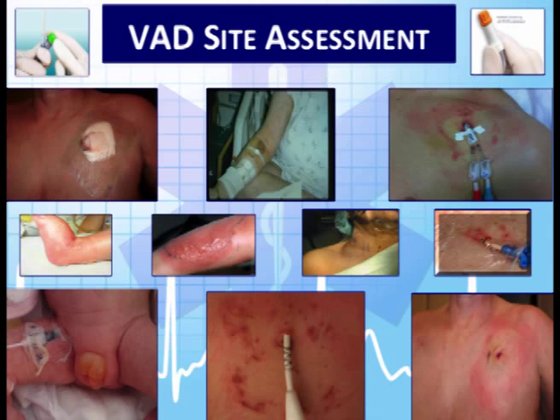Those blisters, what do you think happened there? Yep, probably infiltration of some kind of irritating solution. Poor pediatric patient, the foot, central line device occurred there.